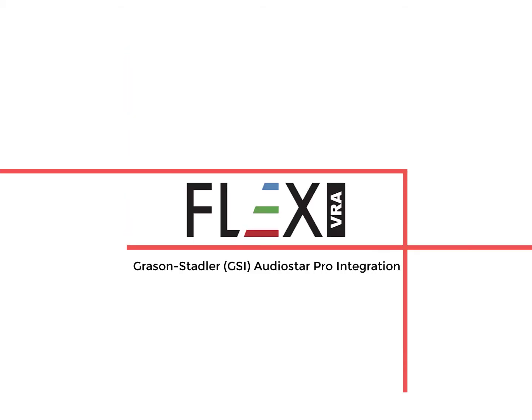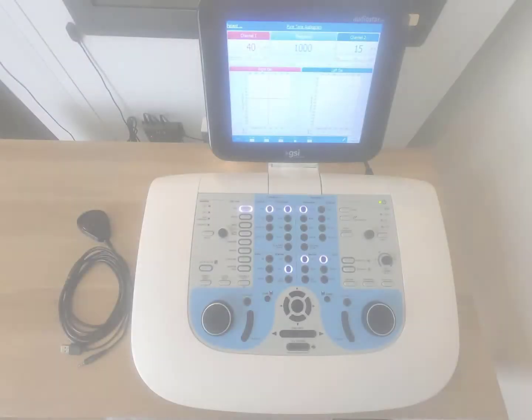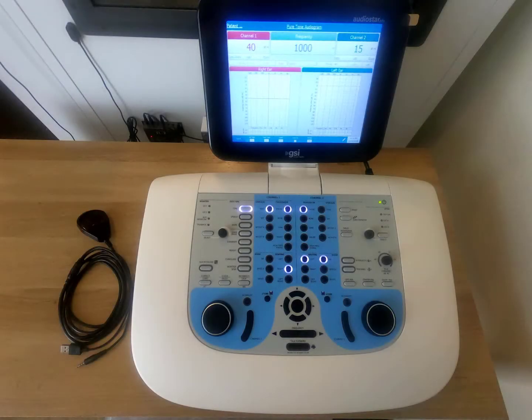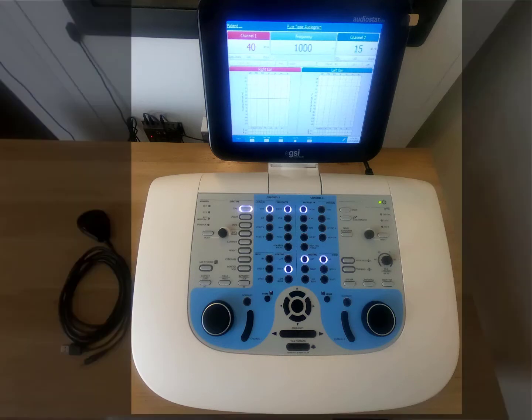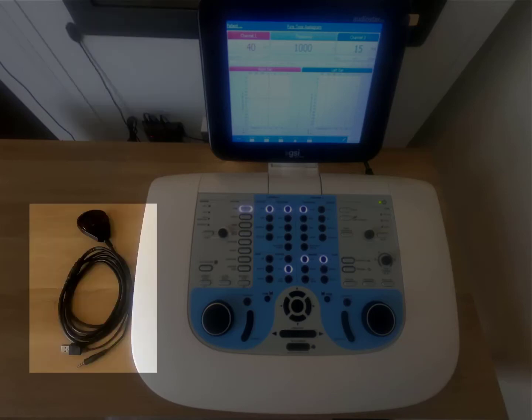Today we're going to be talking about the FlexVRA system integrating into the GSI AudioStar Pro. In order for the FlexVRA to integrate with the AudioStar Pro we need three things: one being the actual AudioStar Pro itself, a FlexVRA system installed as it normally would be with the IR sensor somewhere outside the booth, and finally the auxiliary cable provided by FlexVRA in order for the AudioStar to communicate with the system.